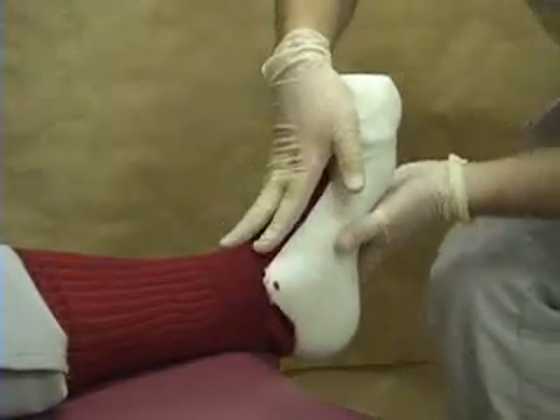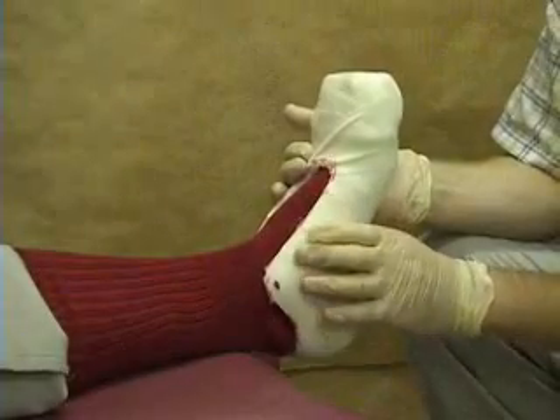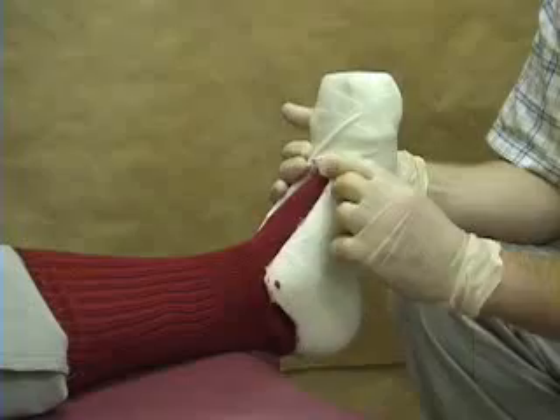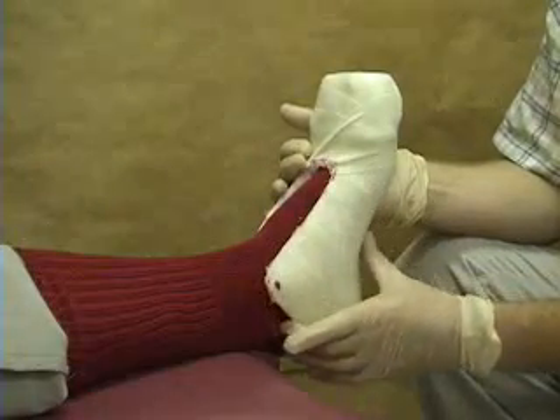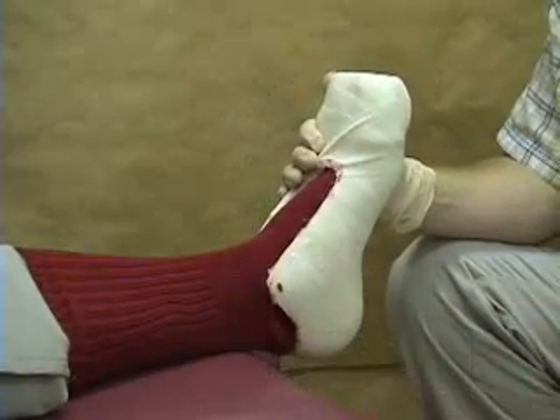We need to make a tongue, a top, for the boot. When we do this, it depends on the situation. We need to have made the final shape of the boot — though this one hasn't had any finishing off with filing — but the actual shape of the boot is in its final form here.